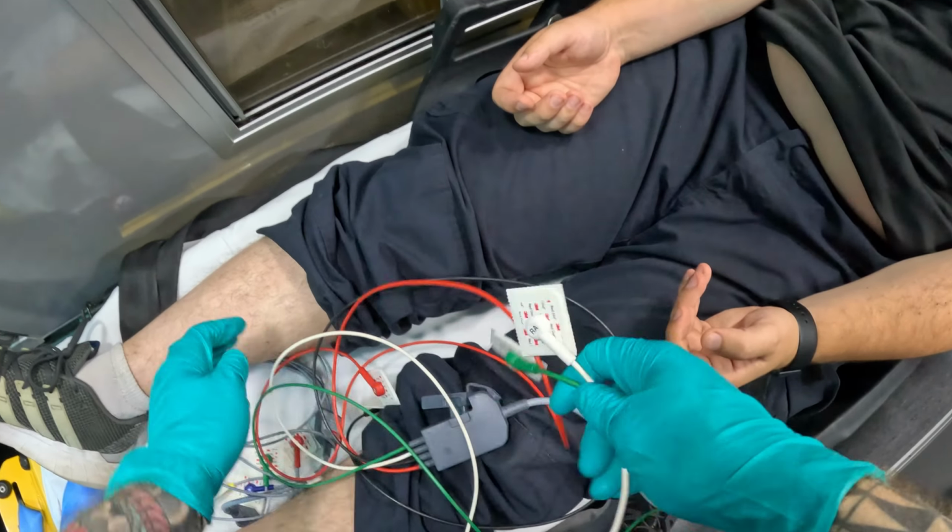The next lead I'm placing is V3. V3 is going to go in between V2 and V4, right there. The next lead I'm applying is V6. And how would I know where V6 goes? Put your hand down. It's going to be the fifth intercostal space, so on the same line, but right under the armpit. So it's essentially going to be the mid-axillary line.